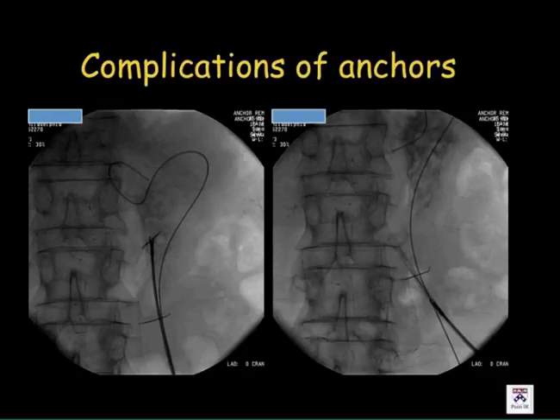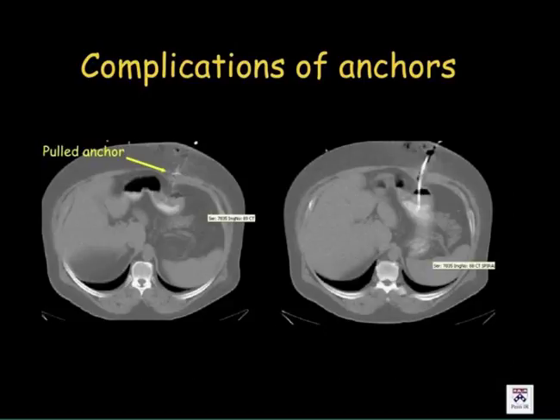They're floating inside the capsule, inside the pus. So you just sneak your, in my case, myocardial biopsy, and just grab them and remove the anchors. This is another example where anchors hurt the patient.